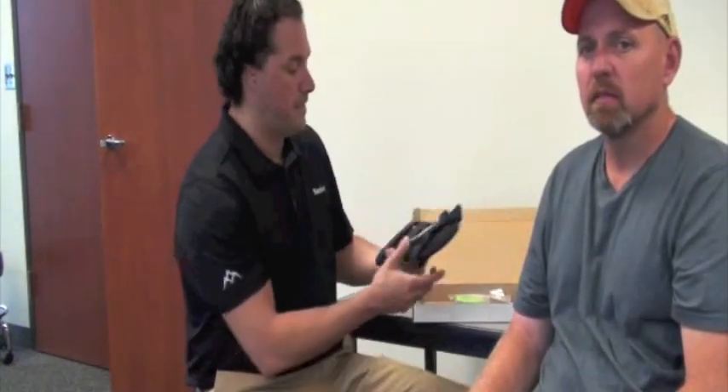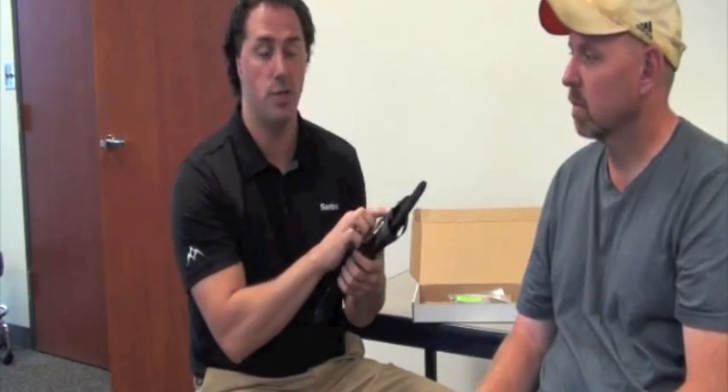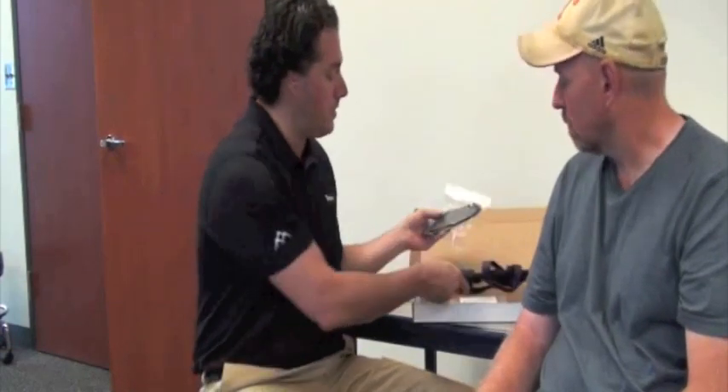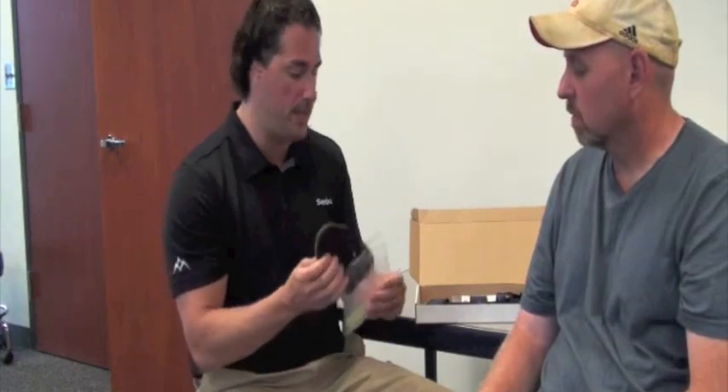Also in the box is the Sabo Stretch, which is in a flat position. Later, we'll show you the appropriate way to bend the wrist mount, thumb mount, and forearm stabilizers to correctly fit the device. You'll notice there are several straps: two forearm straps, a palm strap, two finger straps — one here as well as one in the back — a fifth-digit strap, and a thumb strap. Also in the box are two additional spring steel hand plates.